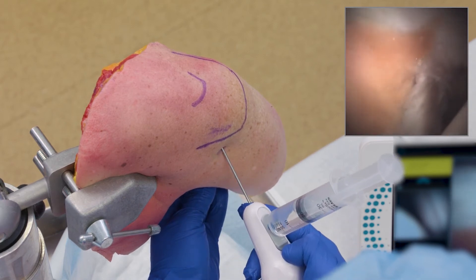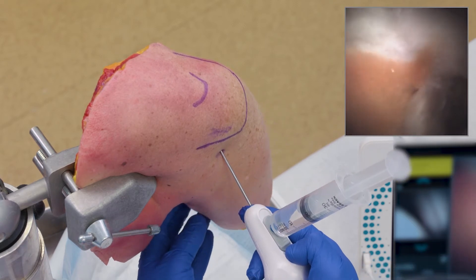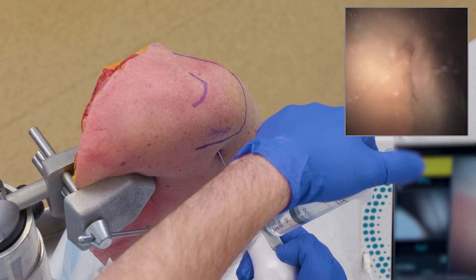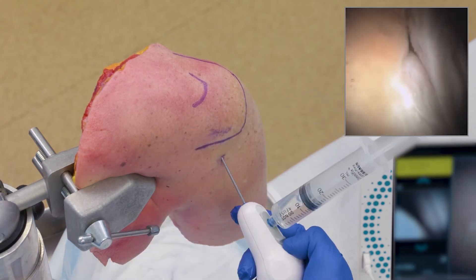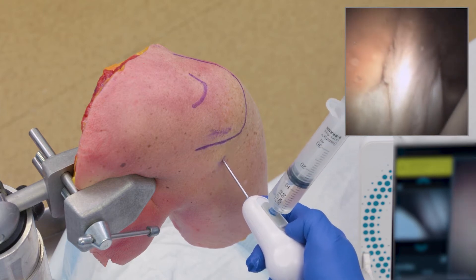I can look as my biceps comes and attaches to my socket and really see where things are. If I have some synovial tissue in my way or some synovial fluid, I can do a gentle flush and blow that out of the way. I can see where my labrum comes down on my glenoid and look at my cartilage as it comes down.